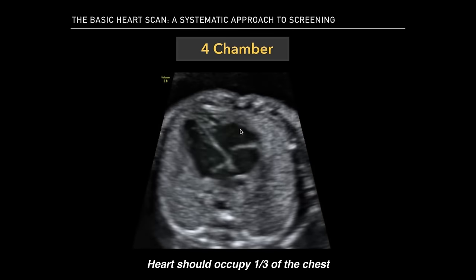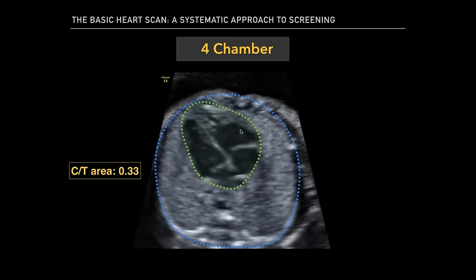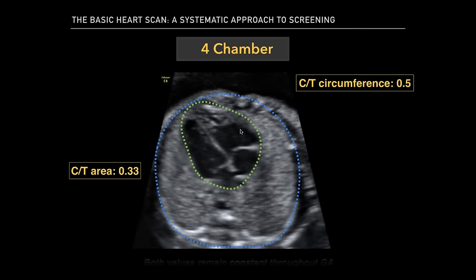So when looking at the four-chamber, the heart should occupy about one-third of the chest. This is assessed as surface area, and circumference is about one-third to one-half of the thoracic cavity in the transverse view. Both values remain constant throughout gestational age.